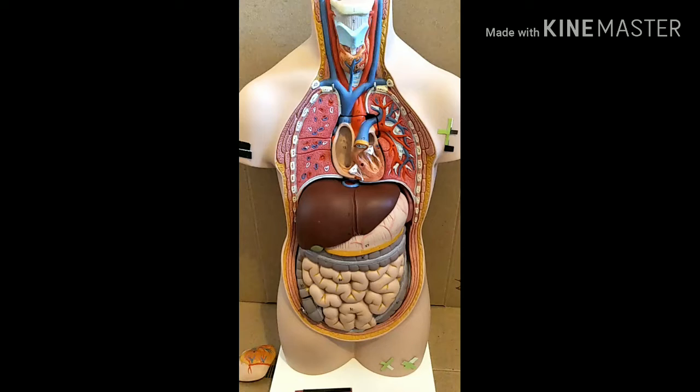And why do you place the electrodes on the arm instead of the shoulder? Because you have more muscle on the shoulder, and we do not want skeletal muscle to disrupt the electrical recordings in our ECG. So we place them in the less muscular areas, which are our arm and our ankle. In this case, I'm going to use the ECG recordings to show why the ECG shows an upward deflection and why sometimes it shows a downward deflection.